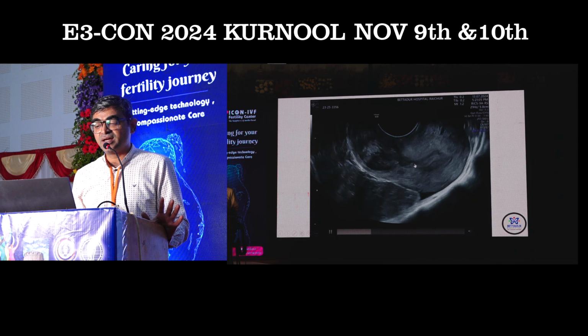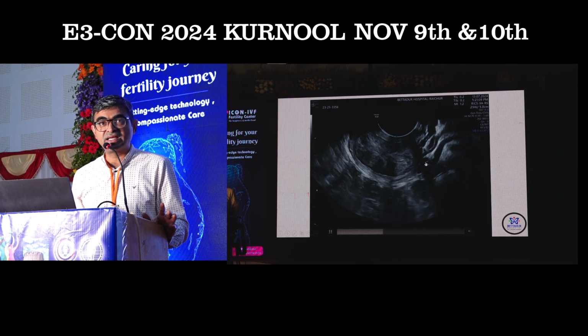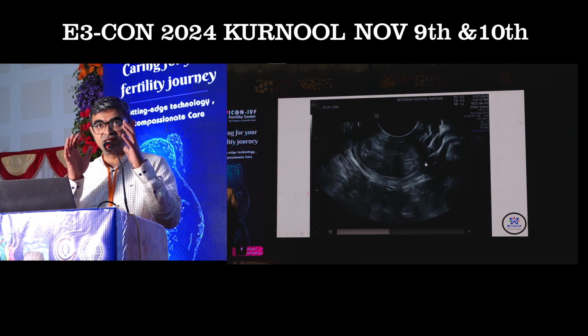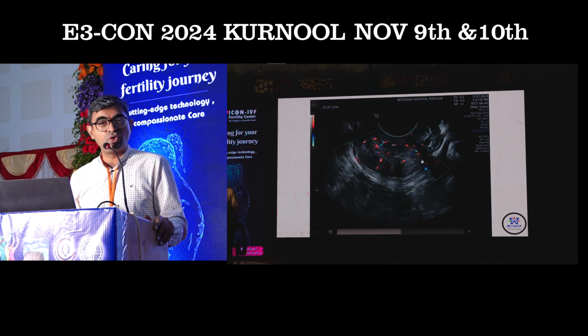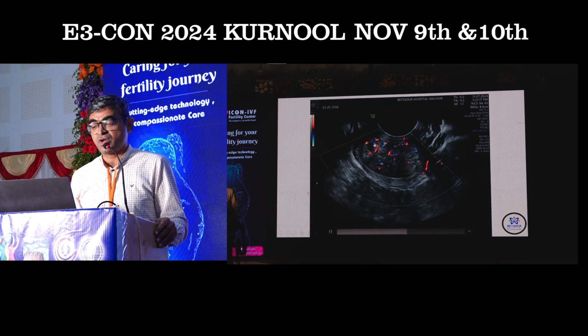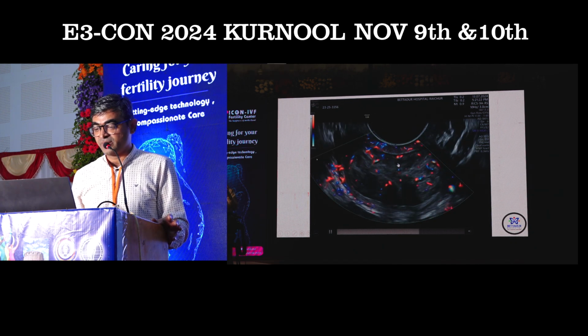So it is actually a submucous fibroid which has got pedunculated and it is sitting inside the cervical canal, and the cervical canal is making its way to widen itself to accumulate this. It has not protruded out through the external os. So I have made a mistake. I should have put color here. That would have taken better.